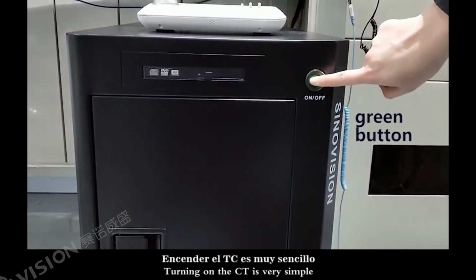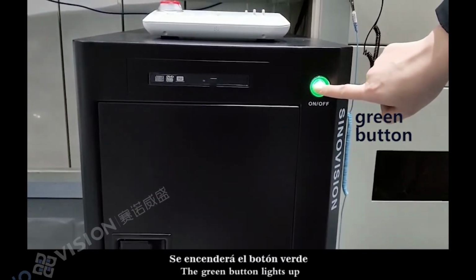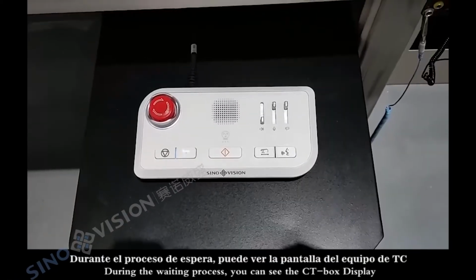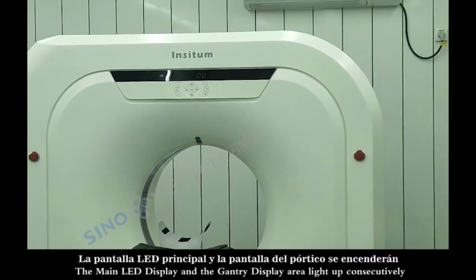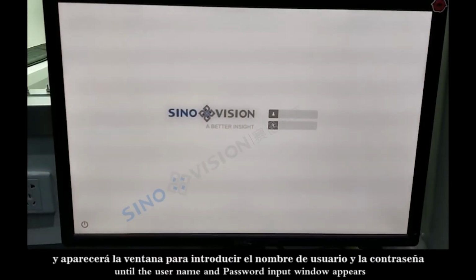Turning on the CT is very simple. Press the green button on the CT console. The green button lights up. During the waiting process, you can see the CT box display, the main LED display, and the gantry display area light up consecutively until the username and password input window appears.